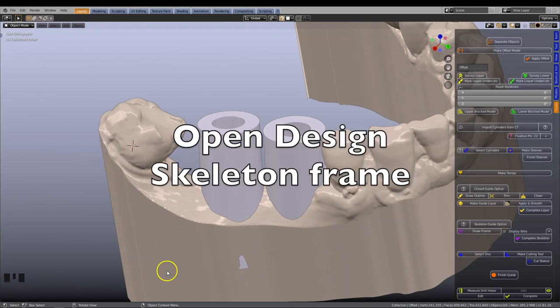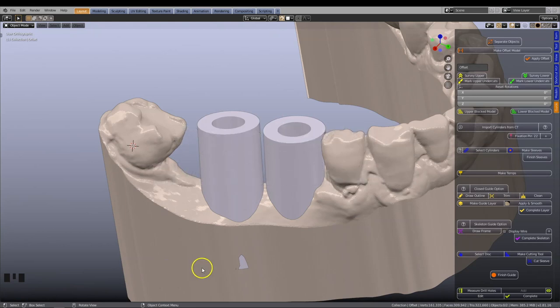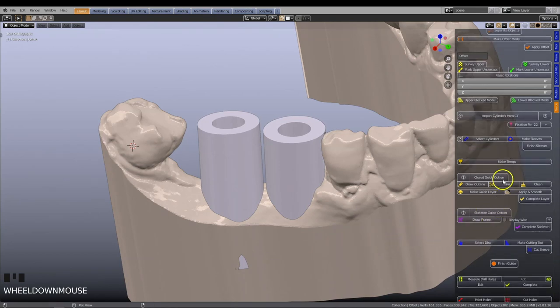In this tutorial, you will learn how to construct an implant guide with an open skeleton design. This option is found directly below the closed frame option.